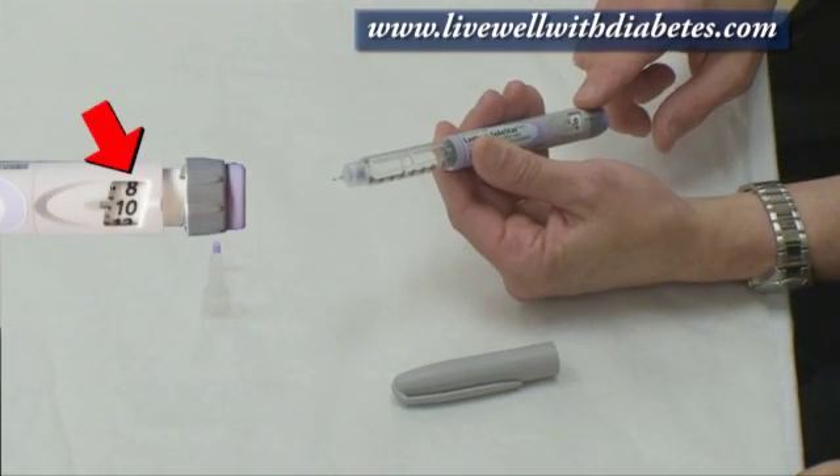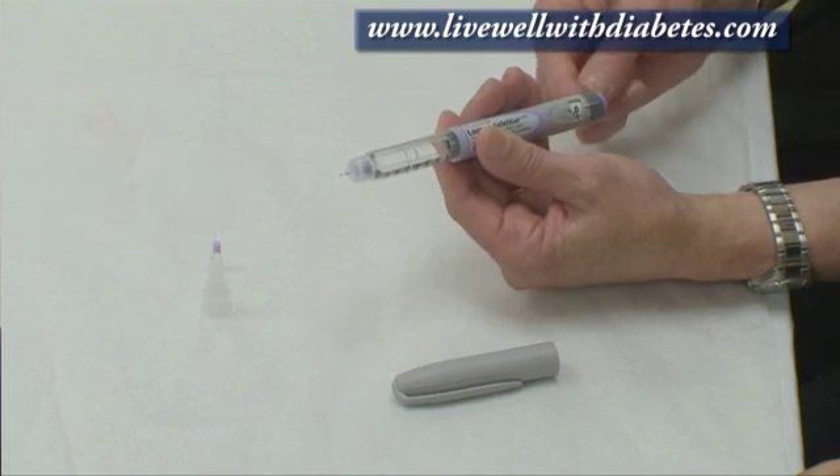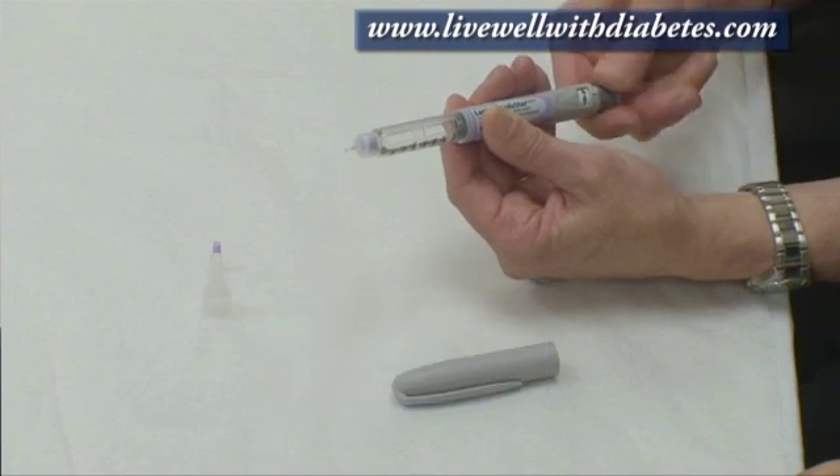On this end over here is the dose indicator window, and on this dark gray end, if I turn it, I can turn the dose. And if I make a mistake, I can go backwards.